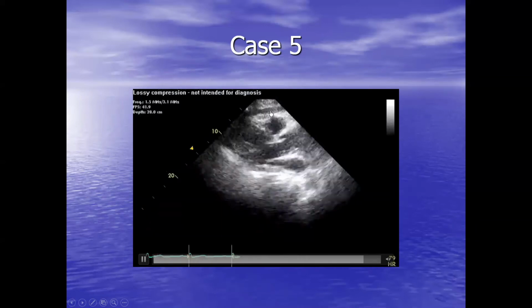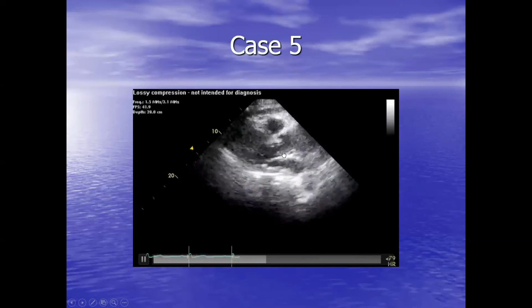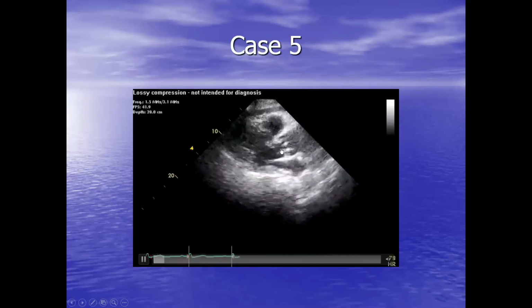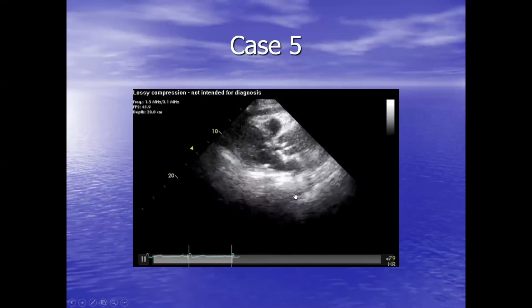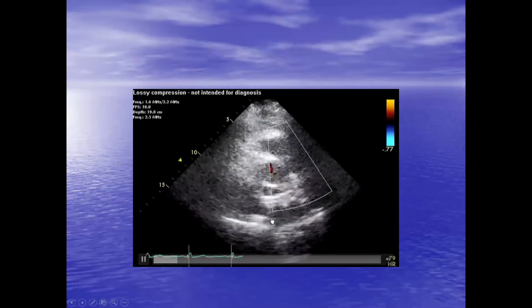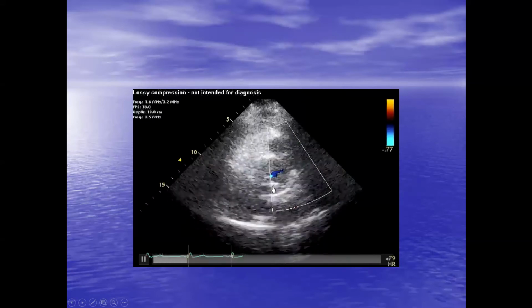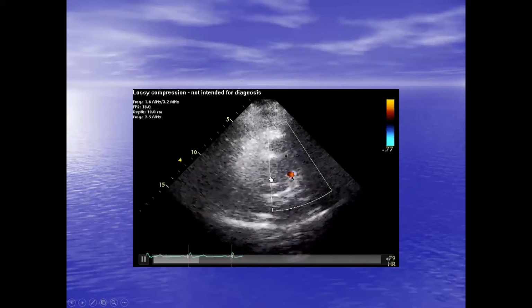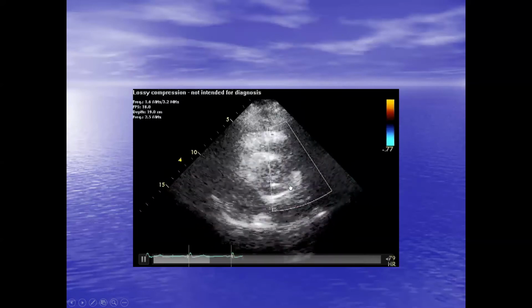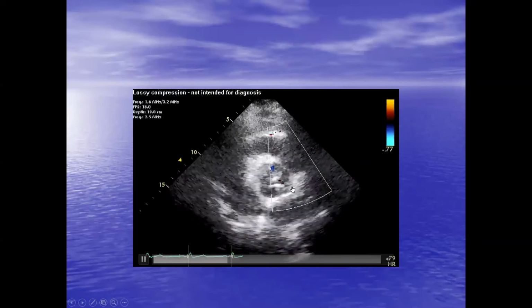But we see here something that looks like the aortic valve and something that's above the aortic valve. Something just not right here in somebody with persistent chest pain. Short axis view, we see something here that does not look like a valve, and our suspicion should be an aortic dissection. In fact, you can pick up half of the aortic dissections simply on transthoracic echo.